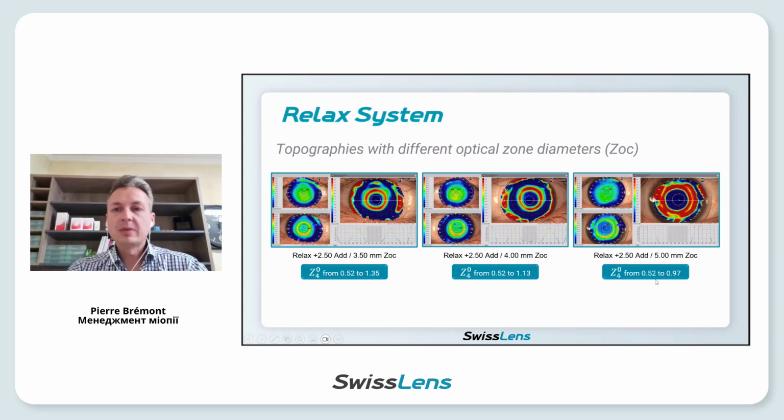We increased only by 0.45, so it's not enough. So the good central optical zone is probably in the middle of 4 and 5 millimeters. But if the patient is okay with 4 millimeters, you can stick with 4 and keep the fitting.